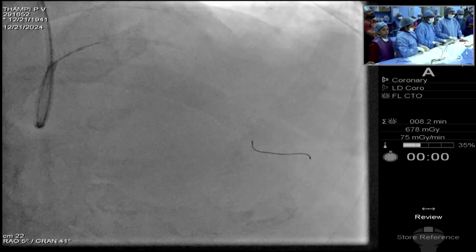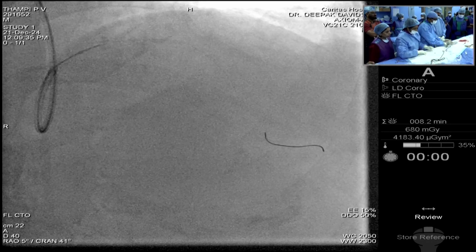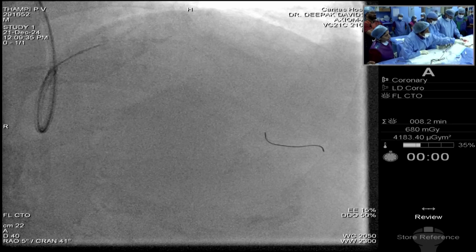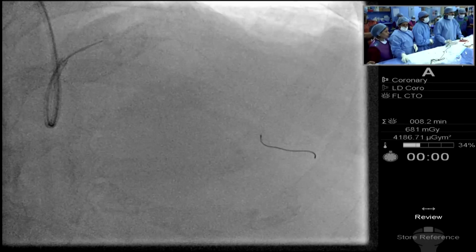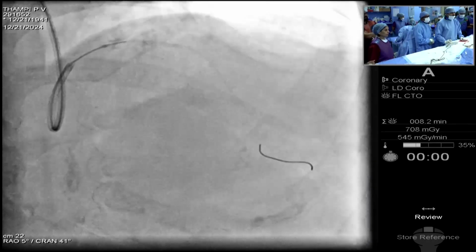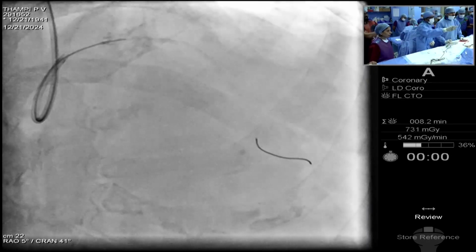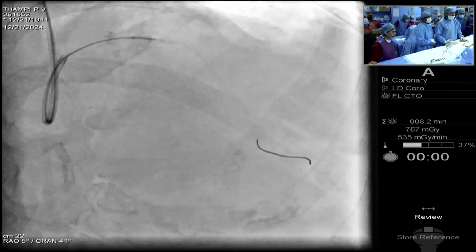Okay, we are ready. Okay, Sini, we are ready. Now I've locked the lock button. Okay. Yes. Distal, the most, yeah, that is the area where we see the calcium.